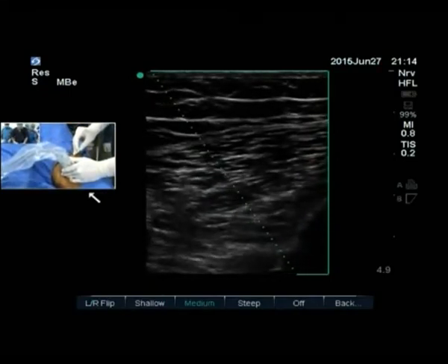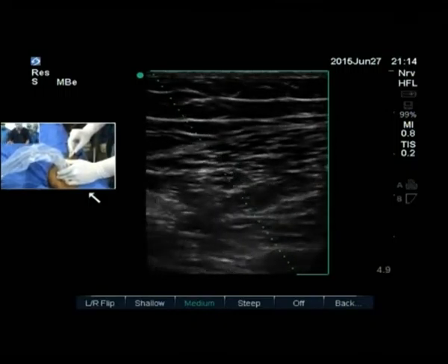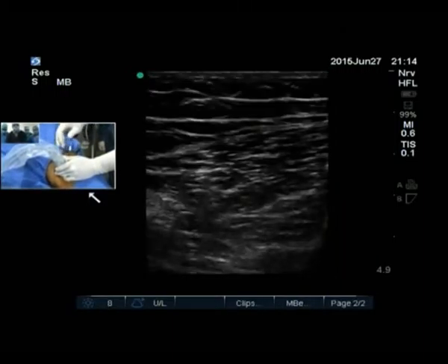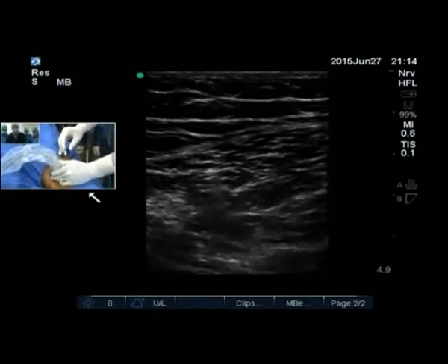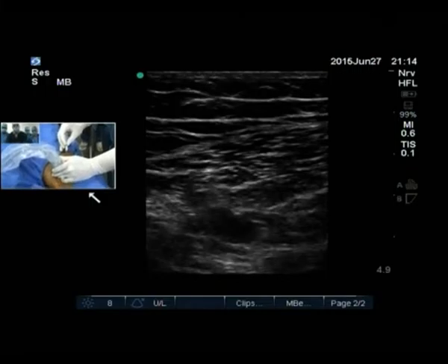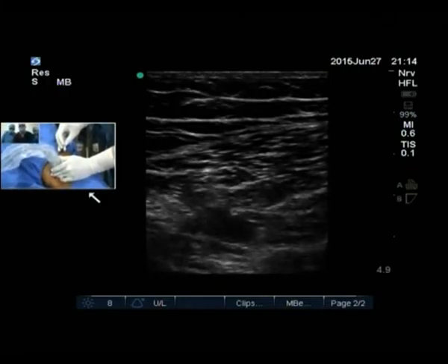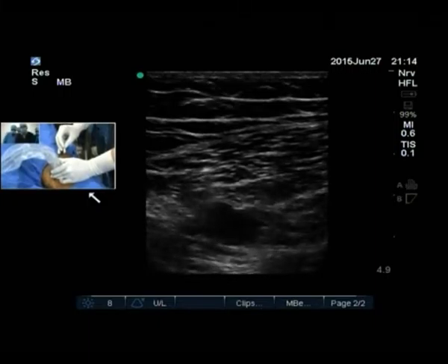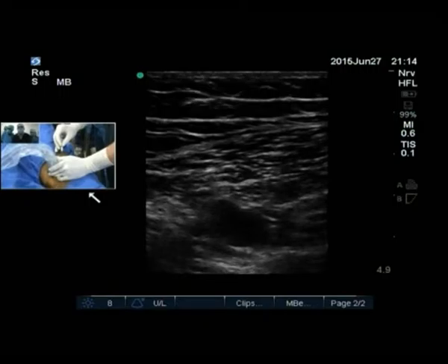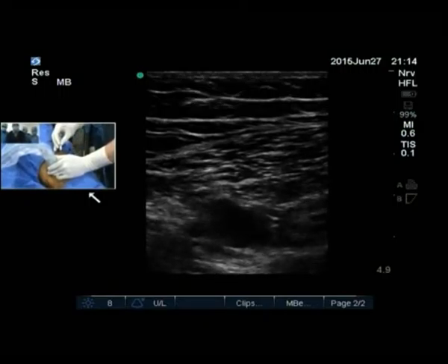What we will do is, I'll just request my colleague here to make a small injection, and then we will see if we can hydrodissect. Take it off. Yeah, please aspirate and inject. Can you see the drug being spread in the vicinity of the artery? Absolutely, yes. Okay, can you continue to inject? We'll inject about 15. So we see an anechoic zone just below the vastus medialis muscle? Yeah, and it is spreading in the vicinity of the artery, Bala. Yeah, that's right, yes.